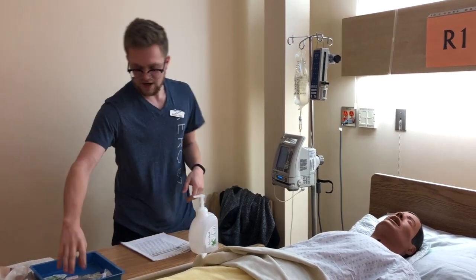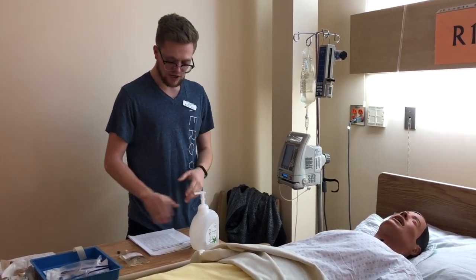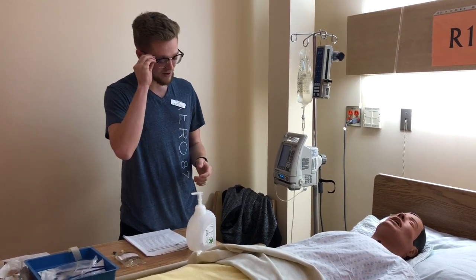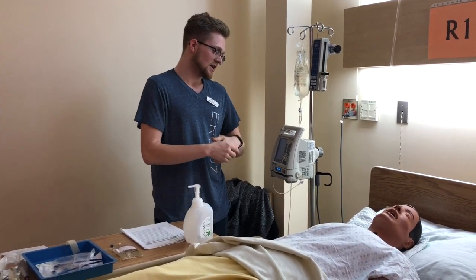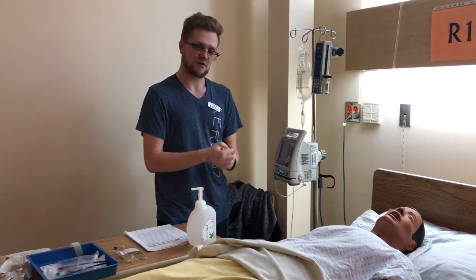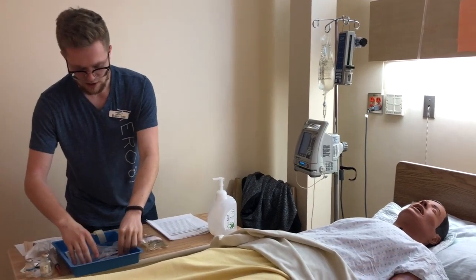And so we're going to explain what this medication is. So, Mr. Kent, we're going to be giving you some cloxacillin for the infection that you have, for the pneumonia. So the common side effects of this drug are nausea, vomiting, and diarrhea. So if you do have any of that, please let me know, and we will attend to that accordingly. Do you have any questions? He's been very quiet all day, so luckily he doesn't have any questions for me. And he does have the right to refuse at this time as well, just to note. So now we're going to be getting ready to hook all this up. So we're going to be spiking our bag here.